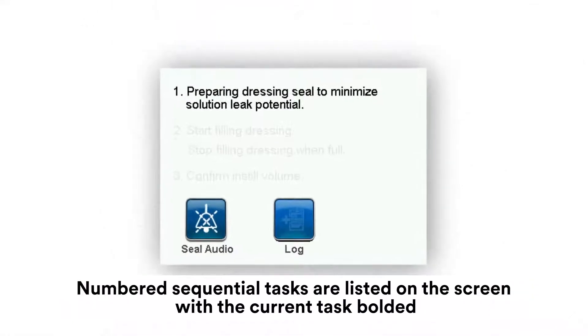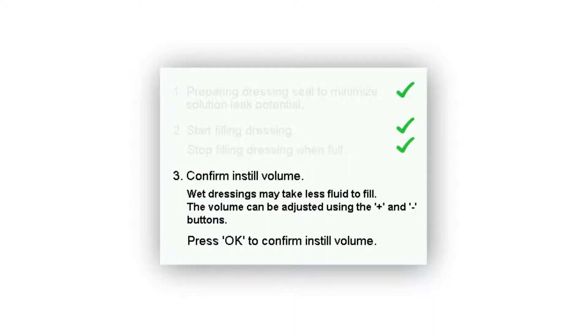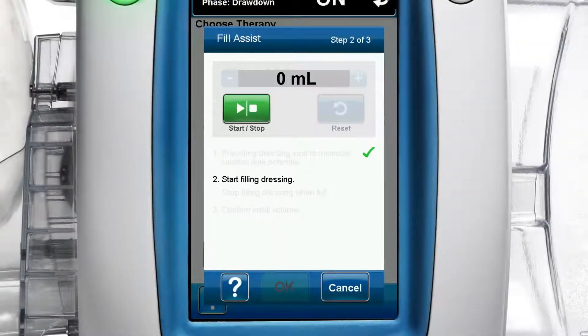Numbered sequential tasks are listed on the screen with the current task bolded. A check mark appears and that task is greyed out once a task is completed. The therapy unit automatically advances to the next task and displays the next instructions, which will be visible and bolded. Once a good seal is confirmed, step 2 of 3 appears.